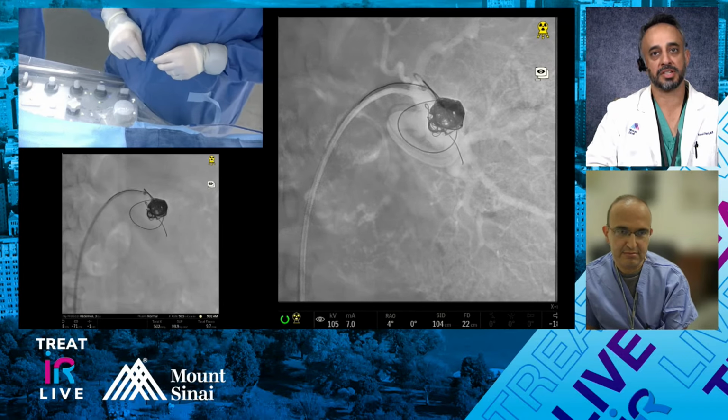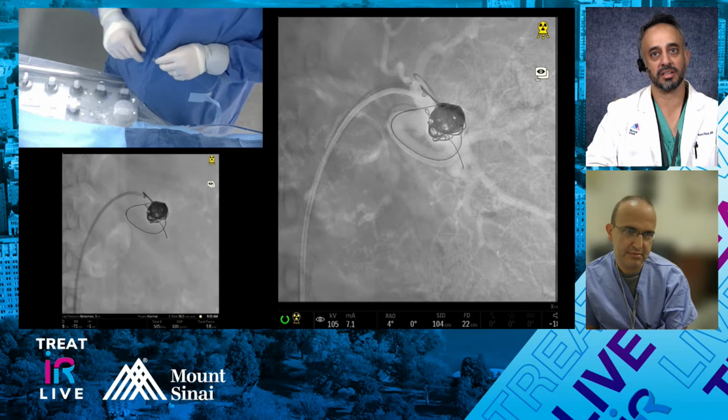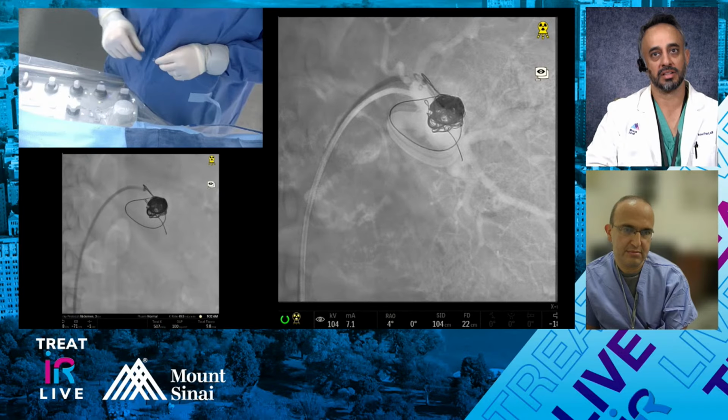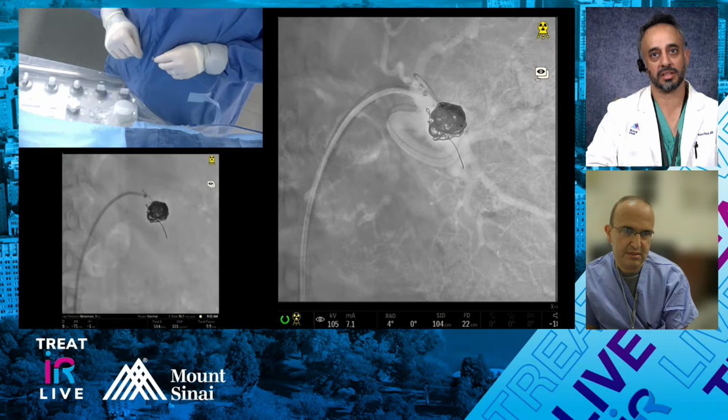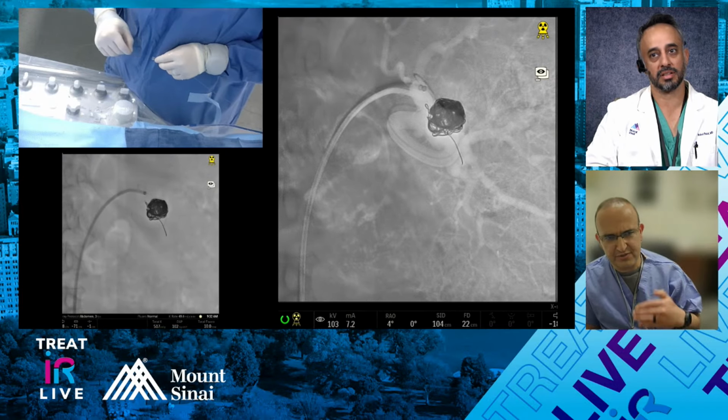I have not, but that's actually interesting. I've done it, I think, once, but I've not felt really a need to do it in most cases, but it's very clever. It also tends to anchor your 16 catheter so you can go further.